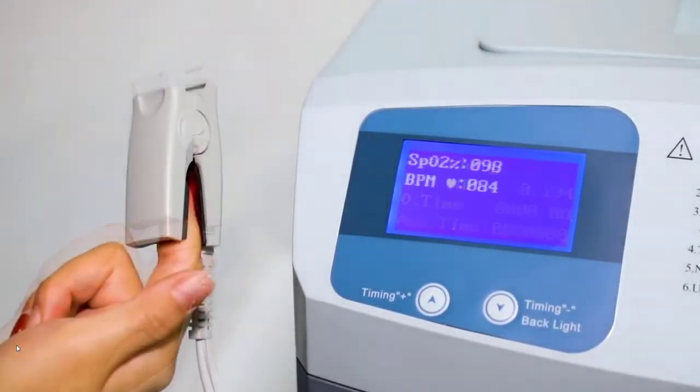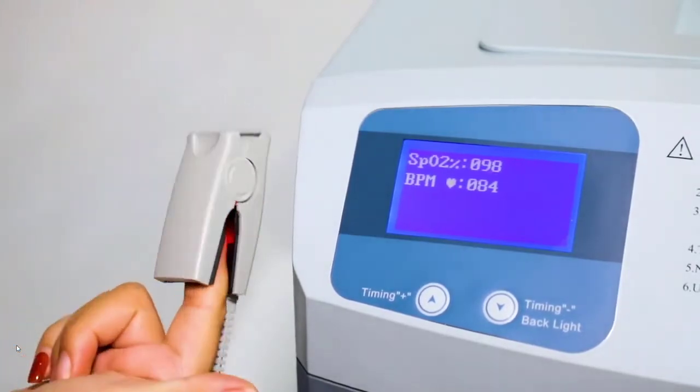Insert your fingertip to detect oxygen saturation. The screen will display the detected saturation.